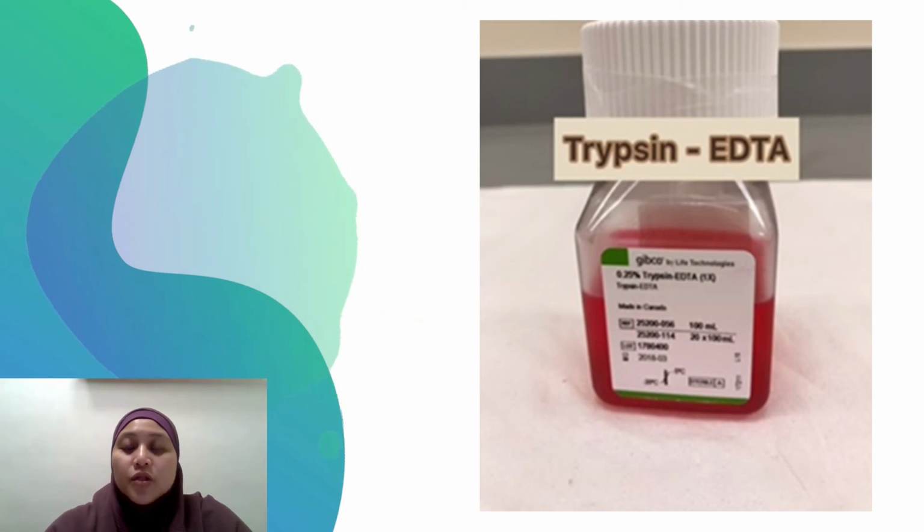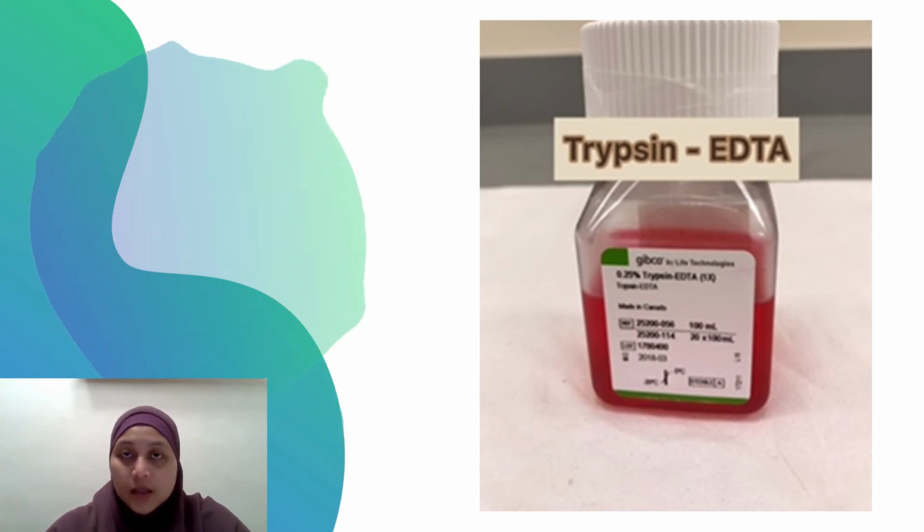The optimal pH for trypsin activity is 7 to 9. EDTA functions as a chelating agent that neutralizes the calcium and magnesium ions that obscure the peptide bonds. The presence of serine protease inhibitors such as aprotinin might inhibit the trypsin activity.